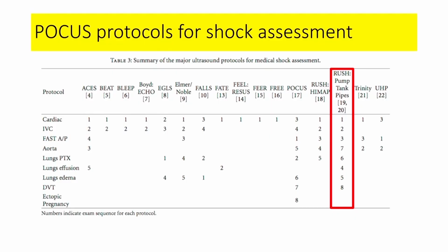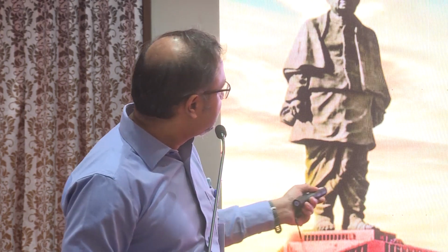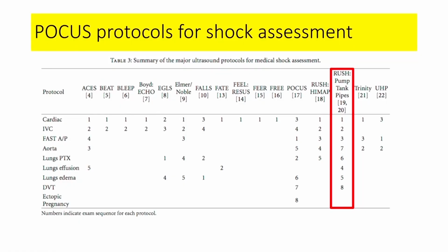So as I said, a protocolized approach is most important, and there are multiple protocols which are being created over the years by these classy, stylish names. The most common or the most popular one is the RUSH. We'll talk a bit more about that. But the integral part of every shock assessment obviously starts with the assessment of the heart. We want to know whether the heart is pumping fine, whether the heart is filling fine, and the heart is ejecting fine. These three are three different things. They're not the same thing. What is pumping is not necessarily ejecting, and if it is filling good or bad, it depends on how well it's going to pump out. So all three are attached to each other.